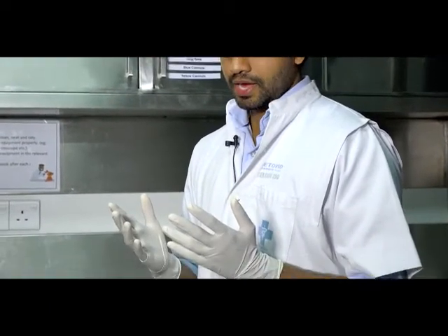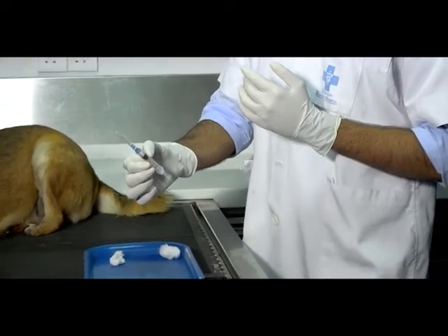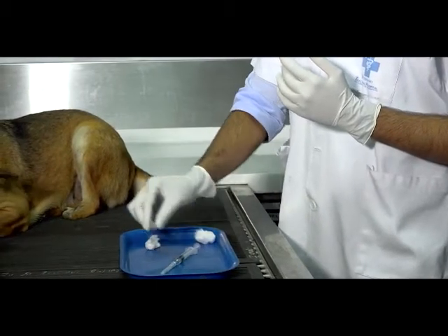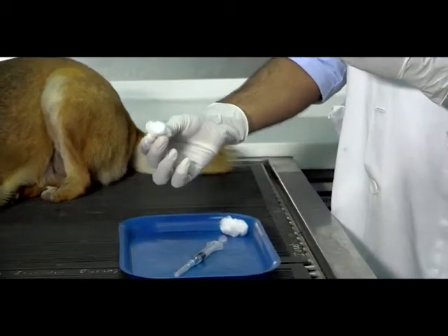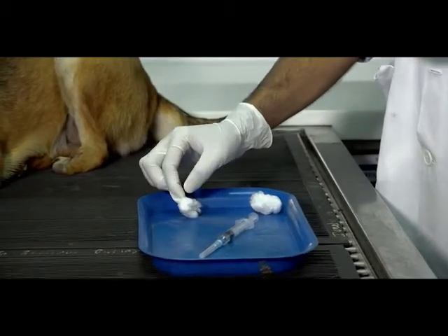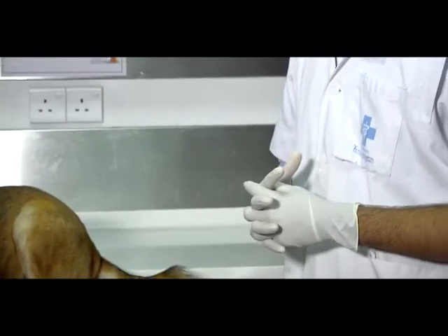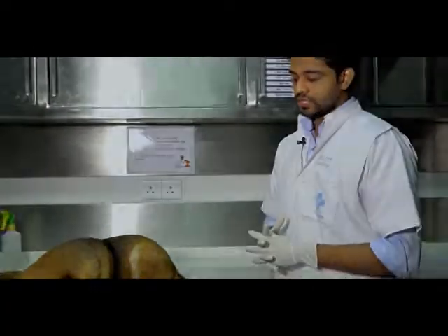For that you will need a sterile pair of gloves, and you will need an injection which is loaded with the required drug and the proper amount, and also cotton swabs with a disinfectant, most likely maybe 70% alcohol. And so we are going to administer the drug in the subcutaneous route to Hamina.